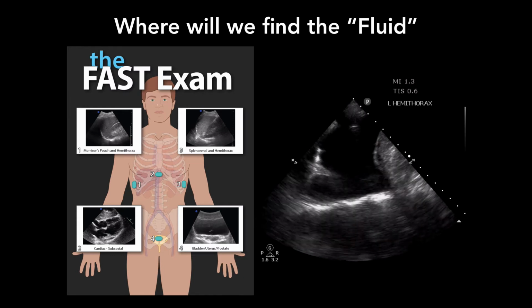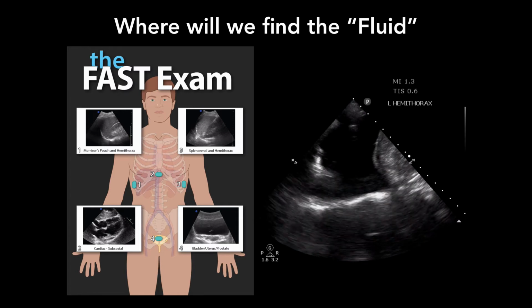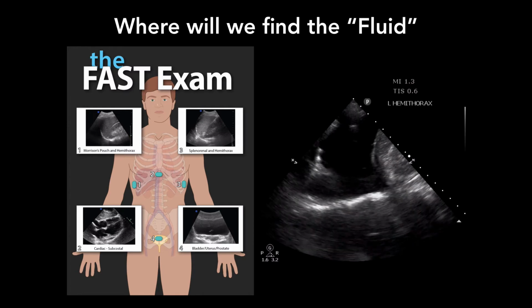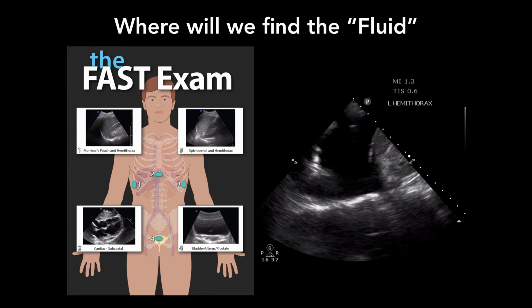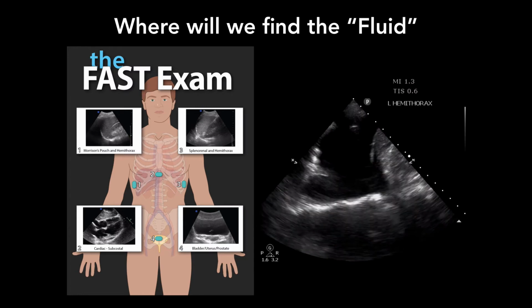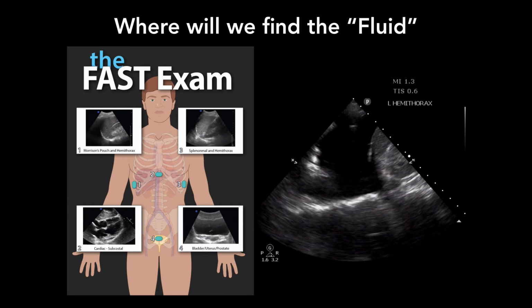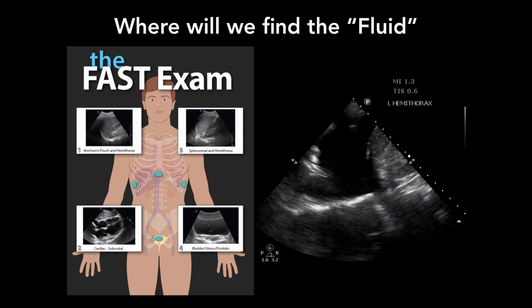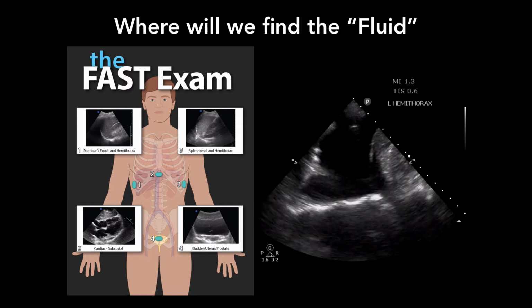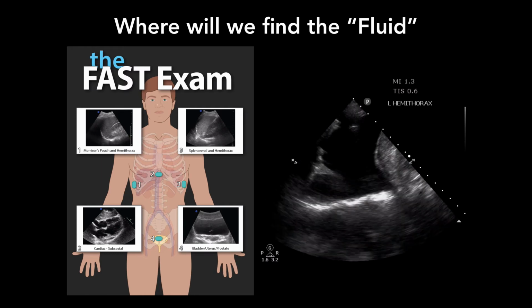What do you think that is? Lungs. Why can you see the lungs? Because there's no air. Remember I told you on the heart that fluid has pressure. And when it has pressure, it affects the other things around it. So the pressure, because there's fluid, keeps the lungs from filling with air, so they're collapsed lungs. And now you can see them because there's no air in them. What do we call collapsed lungs? Do you know what this diagnosis is? Not pneumothorax. Pneumothorax is air outside the lungs. Collapsed lung is atelectasis. So this is compressive atelectasis.